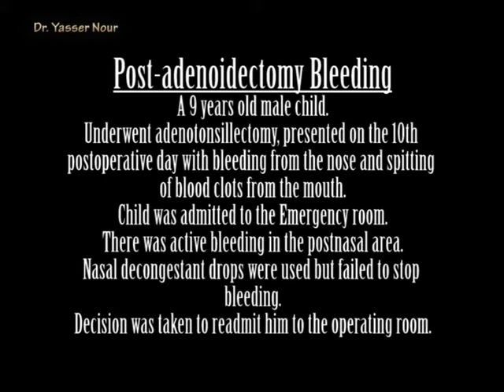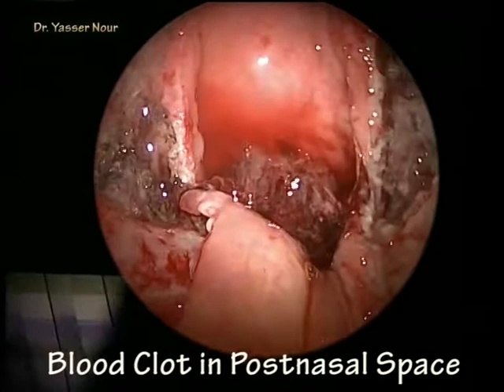He was admitted to the ward and within half an hour was taken to the operating room. After induction of anesthesia and insertion of the endotracheal tube, active bleeding started and the mouth was full of fresh blood. The nasopharynx was exposed by inserting a catheter inside the nose to retract the soft palate and expose the nasopharynx using a 45-degree lens.